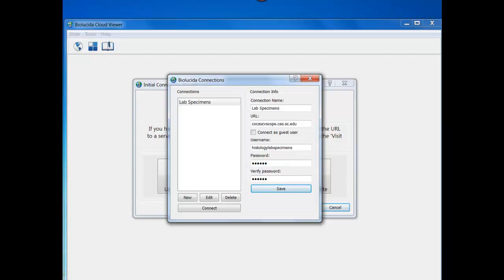to access Blackboard and log into Blackboard within Biolucida, and this is for taking part of a quiz or exam of the course. It'll be part B of each module quiz, part B of the midterm, and part C of the final, in which you'll have questions in Blackboard that have a link to a virtual slide within Biolucida Viewer. And so we're going to change this to quiz exam taking. So we always know that that's the one we connect to take a quiz or exam.